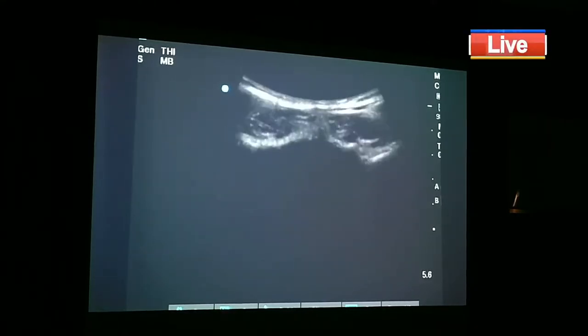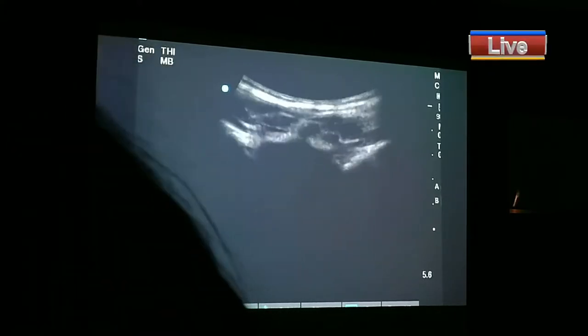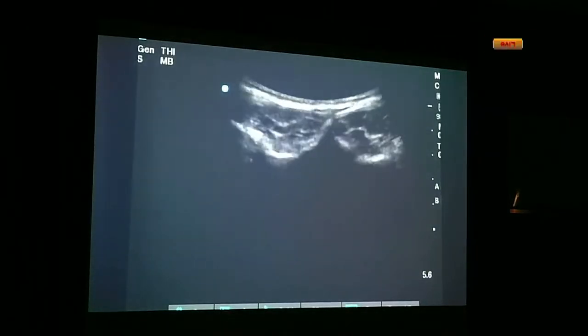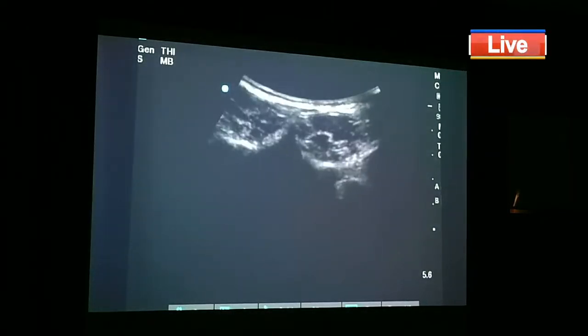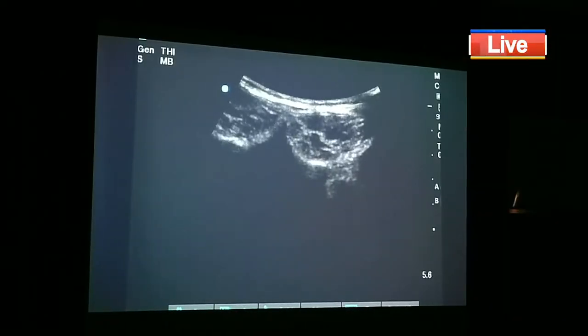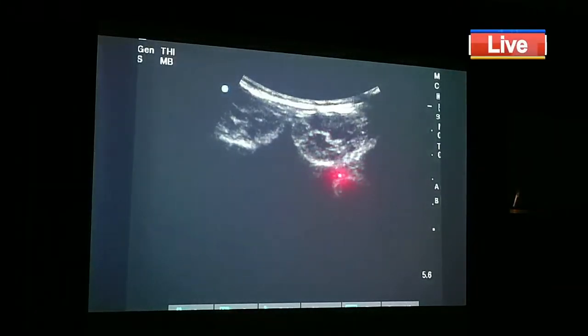We'll start. Now what we are going to do is see that temple-like image I have shown you. Also, if we go laterally we can corroborate that this is continuous, and there's a break wherein the rays will pass through and show the foramen. So there is a break through which these rays are passing. So this is one foramen. So how do you see?